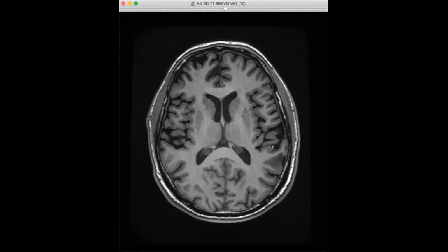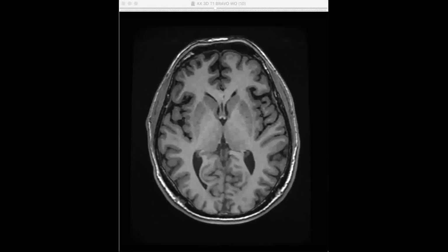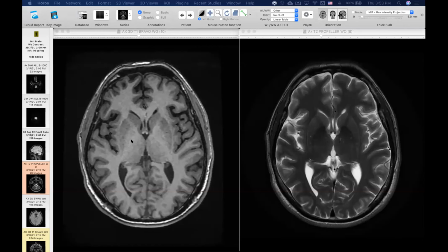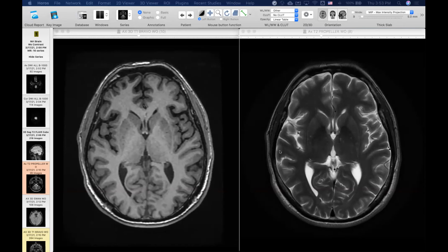So this on the right is a T2 weighted image. And you can kind of see the difference now, right? We only see one head. Oh, really? Oh, interesting. So maybe I'll share the entire window. It's a Zoom thing. Okay. So on the right-hand side, you can see a T2 side by side next to a T1.